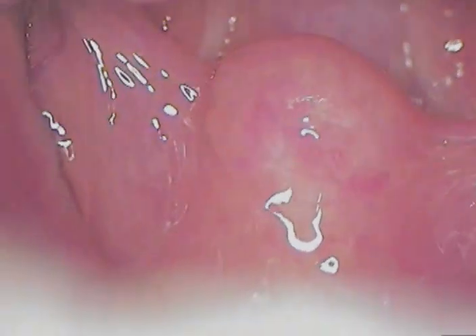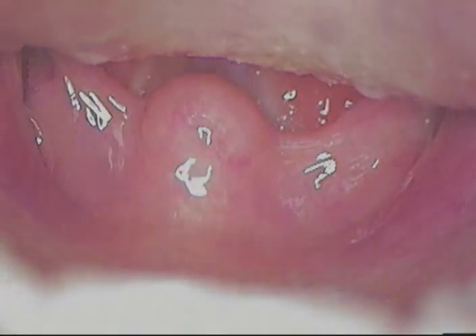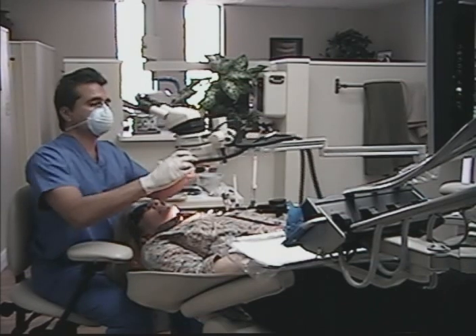One more time down there. Okay, just say 'ah' for us. And 'ah' again. Take photographs, whatever you have to do to record the data.